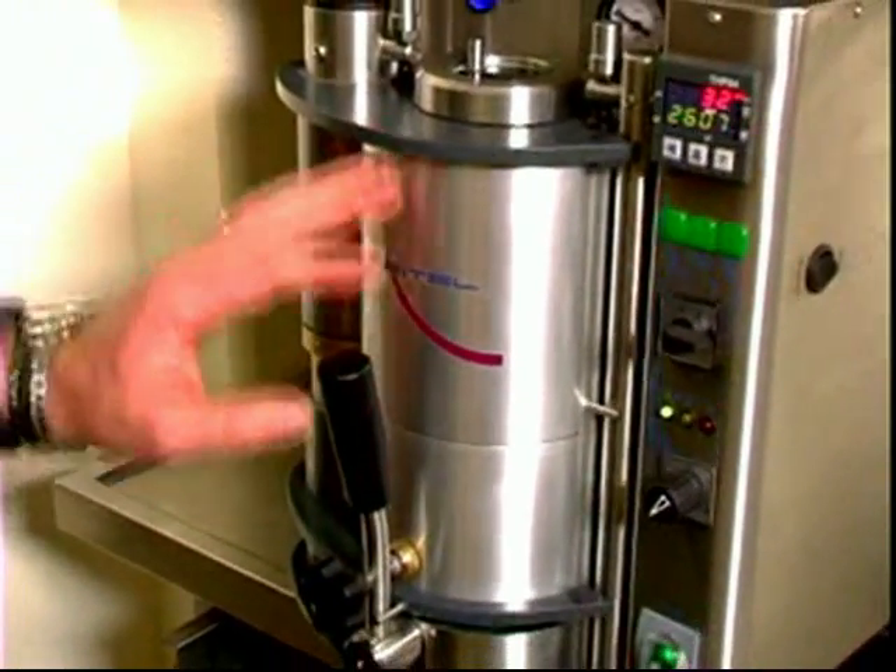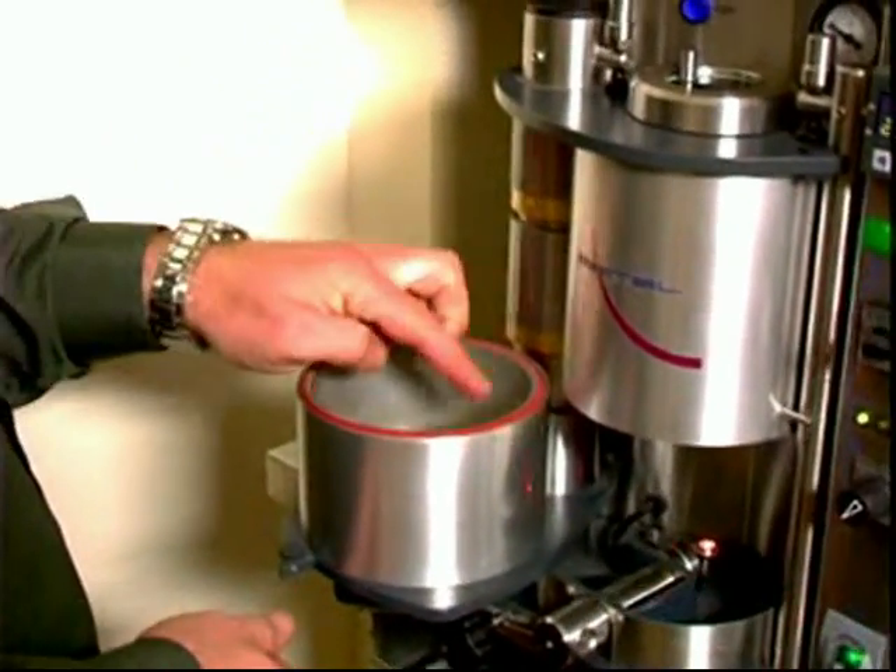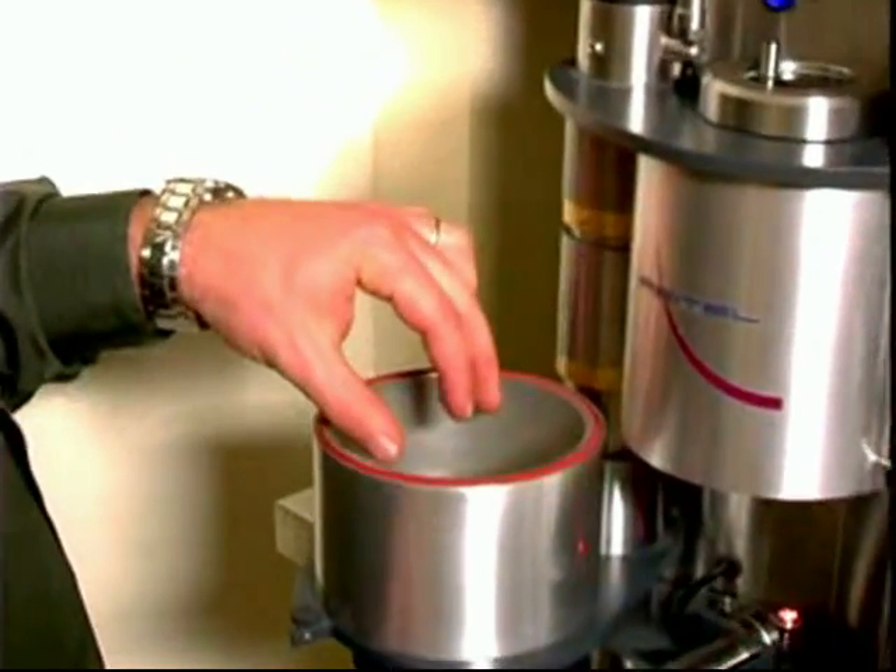Here is the vacuum chamber. Move the lever to the left, then open the bottom drawer. This is where the casting ring goes.